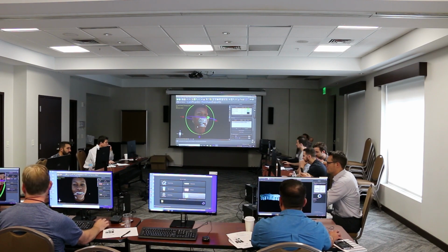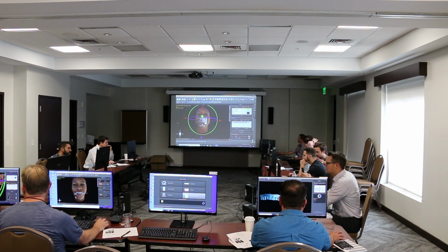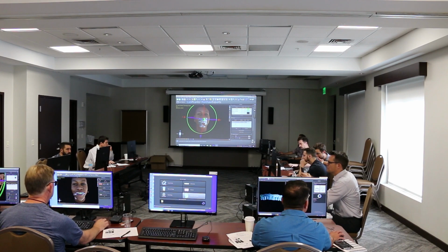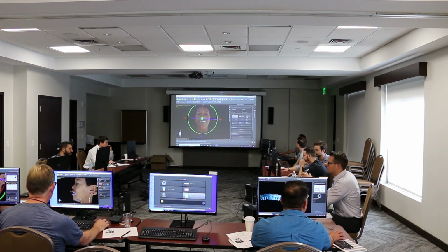And remember this, think about what we're using this for. Accuracy and exact stitching, it's not like we're using this to place implants. This is just to help us set teeth in a rough position, just so you can evaluate aesthetics. As long as it's kind of close. Exactly. It's an adjunct. You guys might find that you only use this for patient experience, wow factor rather than actual diagnosis. But it's a cool thing nonetheless to be able to digitize this patient.